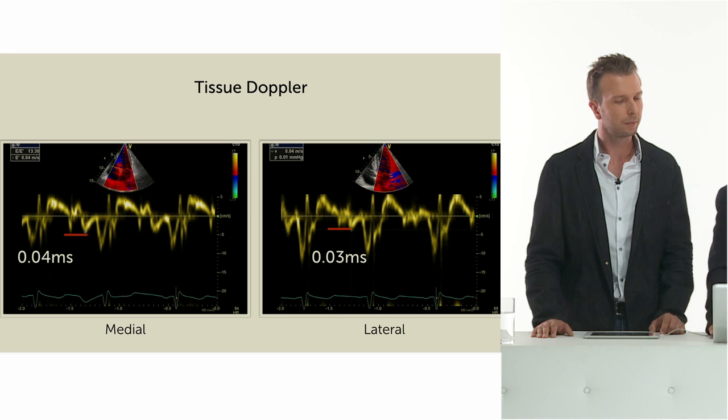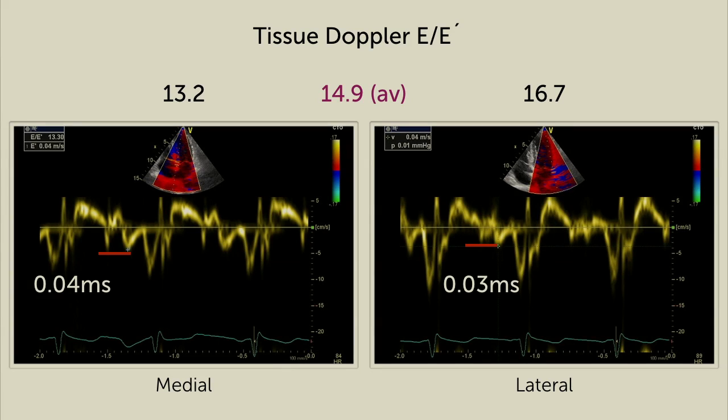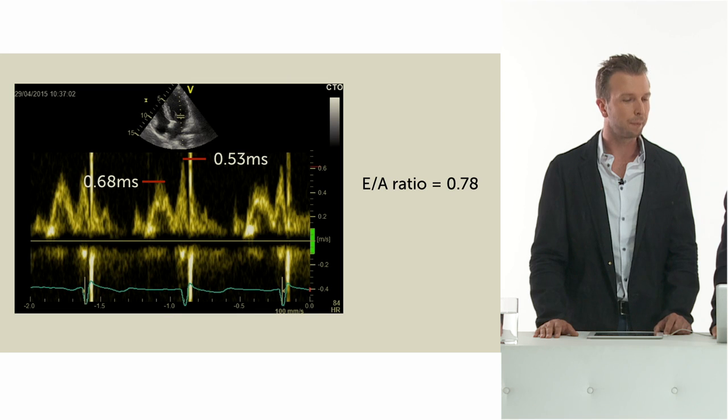Okay, so that's clear. You could actually stop if you do the medial. You don't need to do the septal anymore, right? The lateral anymore, right? No, we can stop. So again, we have a positive, a negative parameter, and then we look at the E to E prime. And it's above the cutoff level of 14, so it's also a positive parameter. So after that, we could say it's elevated, it's a diastolic dysfunction.